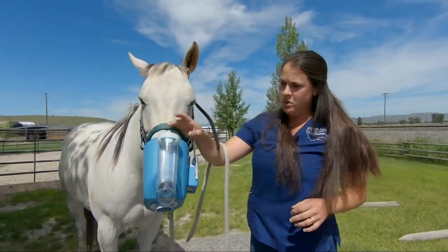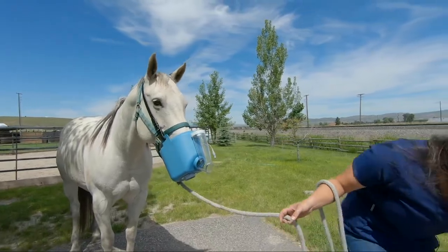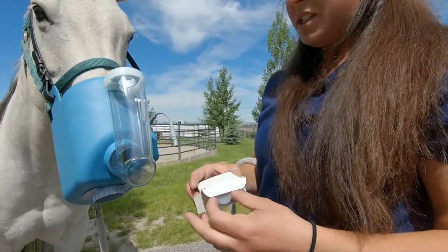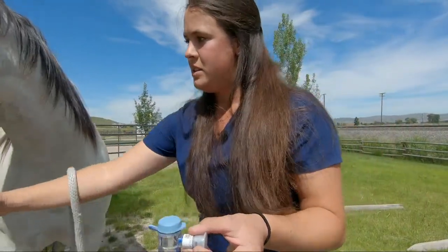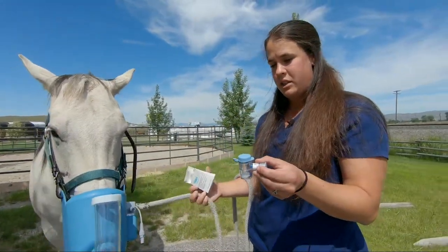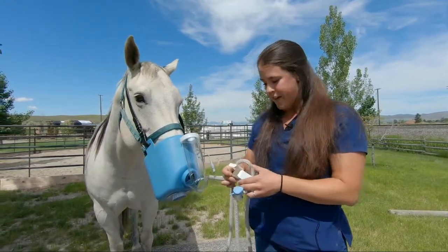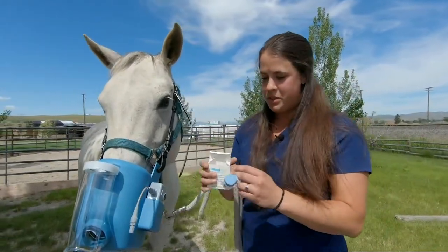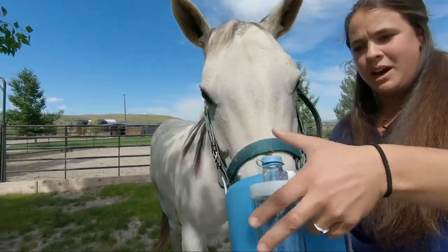The next thing that you'll do is place the cup onto the actual device. The FlexiNeb comes with what we call a standard cup. The standard cup is a little bit slower as far as the delivery of medication goes. They do, however, sell a fast cup. So what you end up doing is you'll place this cup just directly on the top, just like that.